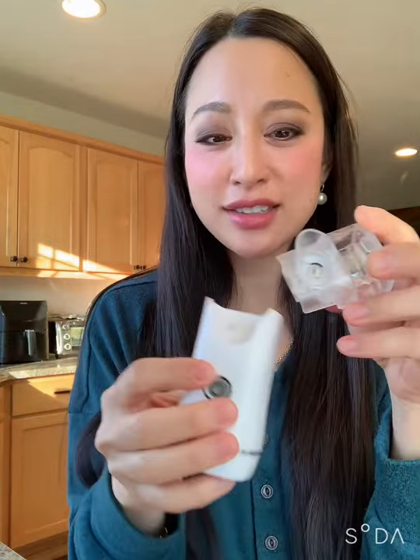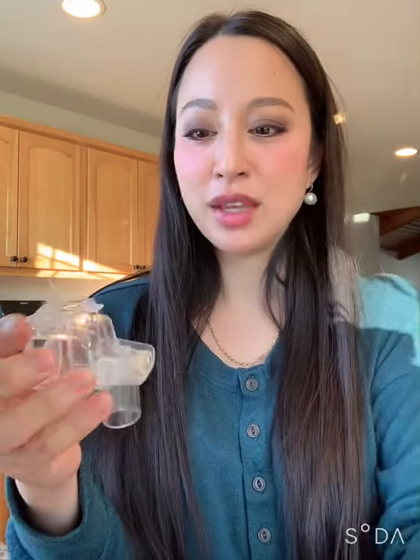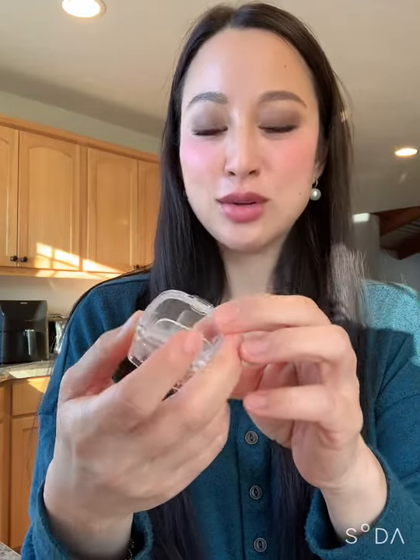A handheld one — these little guys, these travel ones — they're usually battery or USB powered. They have this kind of really delicate metallic membrane inside here that does not need you to clean it with a q-tip. Because if you push it, you'll deform it and then that will lead to it not working no matter what you do.